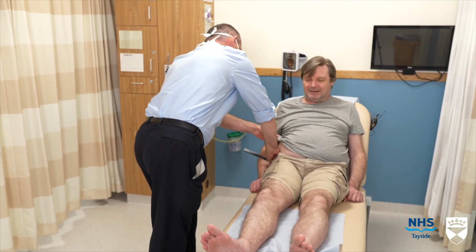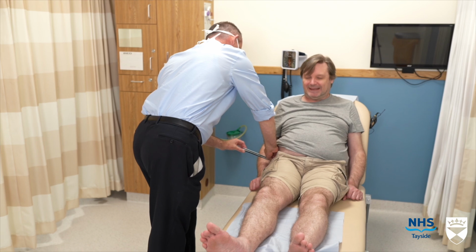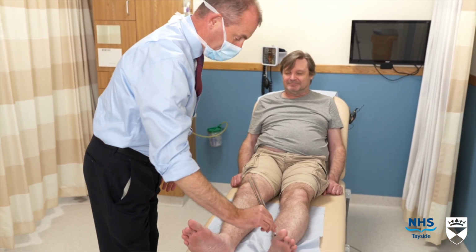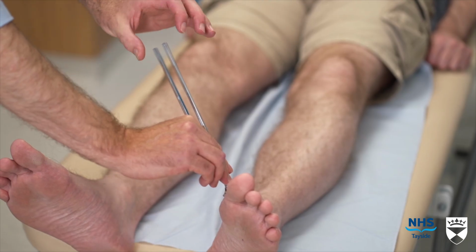Do you feel it vibrating? Yes. Tell me when it stops. Do you feel that vibrating? Yes. Tell me when it stops.